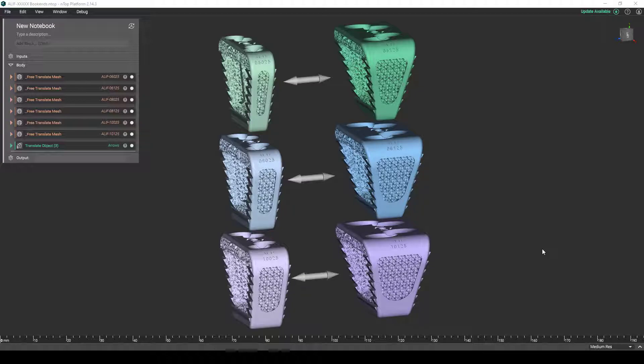ALIF here standing for anterior lumbar interbody fusion. Though it may seem very specific to the medical device industry, the insights and workflow flexibilities showcased today are actually very transferable to any other product type and industry application.